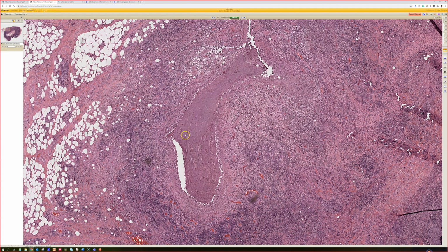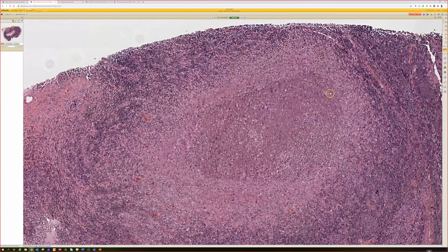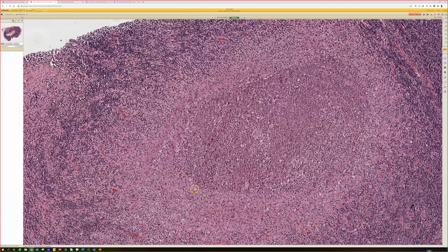Another stellate abscess. Absolutely. And these big granuloma with a big abscess of neutrophils in the middle. And you already mentioned earlier what the differential is for this. Particularly when we see this in lymph nodes, one thing to think of is, anyone know? Yeah, cat scratch specifically. I'm sure other organisms could cause this, but to me, the only times I've seen this in a lymph node, it ended up being cat scratch disease. So I feel like it's very distinct.